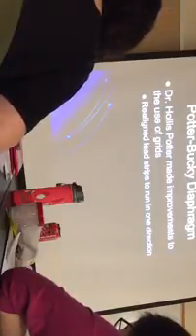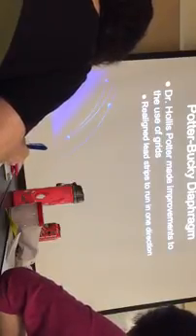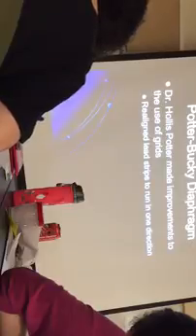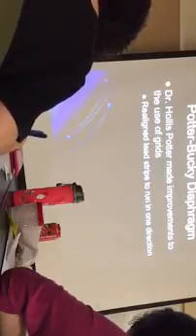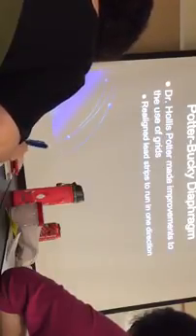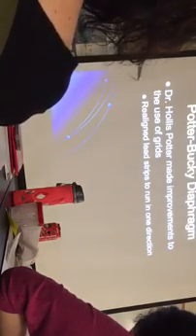So what he did, and instead of having, remember last time when I was describing what Bucky had done, I said that grids were cross-hatch grids, like this, right? And so what Potter did is he said, well, we don't really need to have lines in this direction. Let's just make grids in one direction, like this, okay?